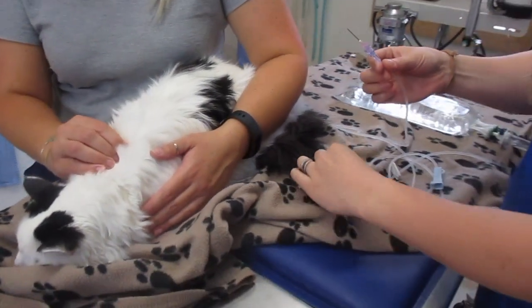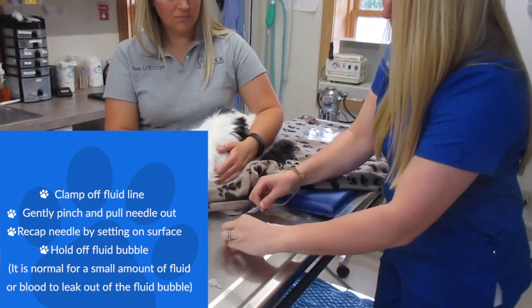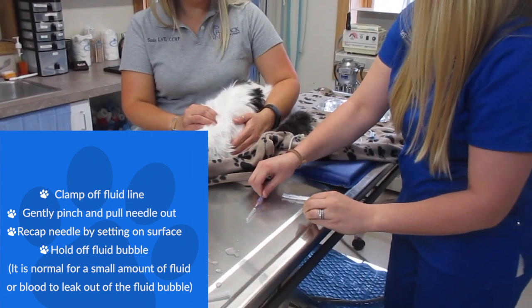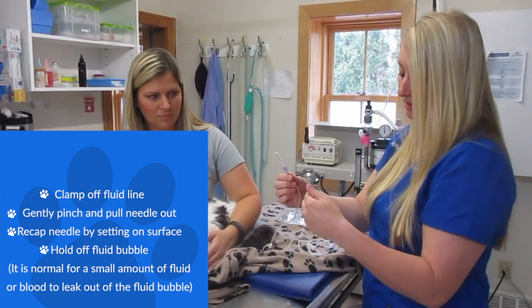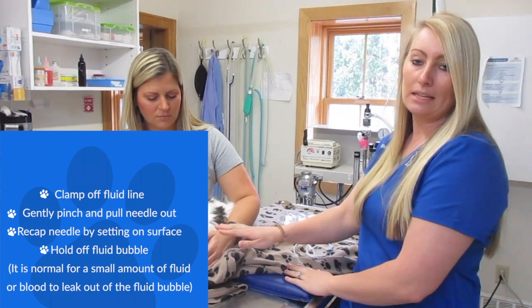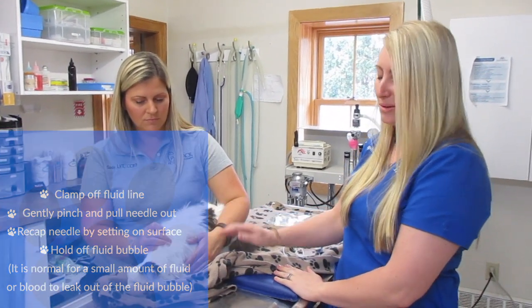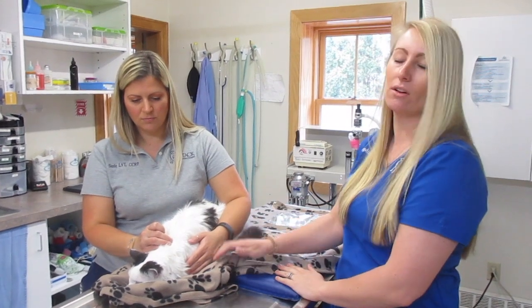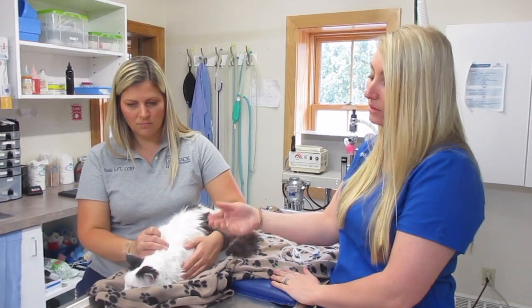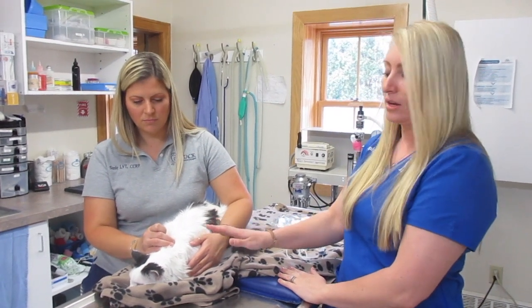You want to recap your needle. Careful with doing that. I usually set it on the table and then just stick my needle in so that I'm not accidentally poking myself. And then if you do see a little bit of fluid leaking out, that can be normal. If you do see a little bit of blood as well, that also can be normal. Sometimes we hit what we call a little skin bleeder, either on the way in or the way out. But other than that, you can just hold off the area for a couple seconds.